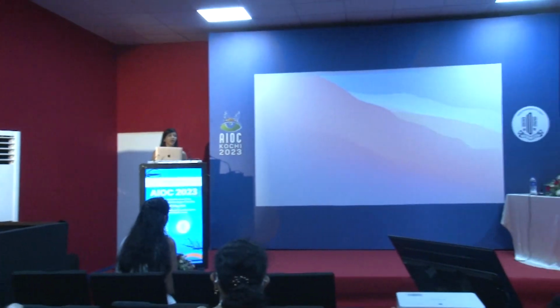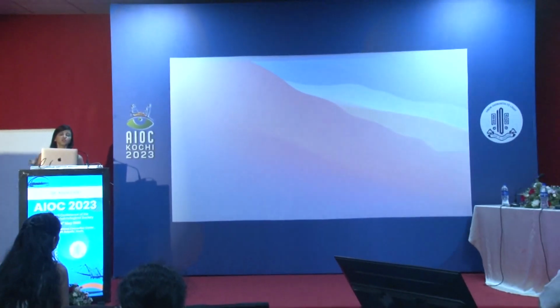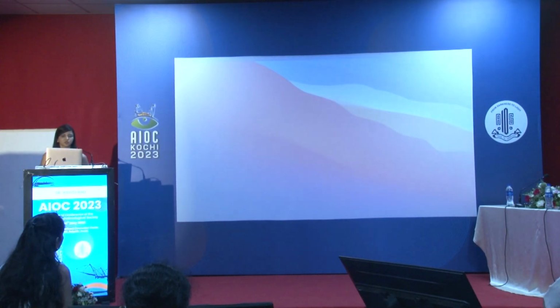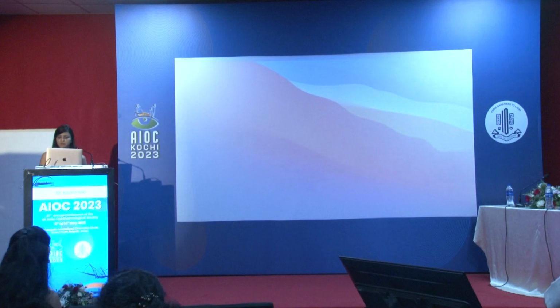A lot of these patients are very keen, they want a good result. And of course this was combined with cataract. Even if you're doing the pterygium first, most likely they come to you just for the cosmesis. That's the reason I also don't block, because in pterygiums, though I know a lot of surgeons do with block, you end up with those hematomas, which you don't want. So I'm just going to play Sushmita's recorded video.